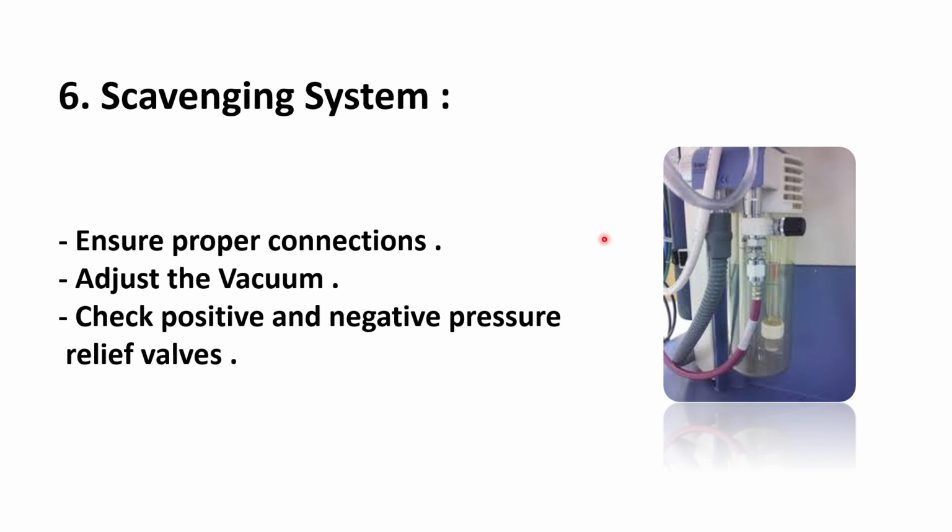Number 6, scavenging system: ensure proper connections, adjust the vacuum, and check the positive and negative pressure relief valves. How to check the negative pressure relief valve? It's easy.